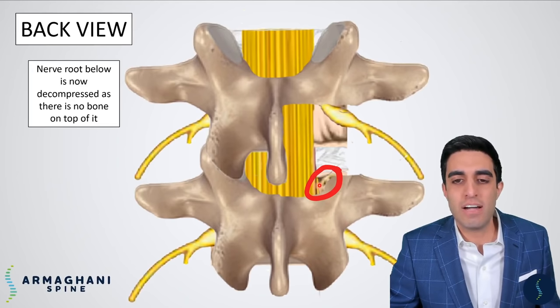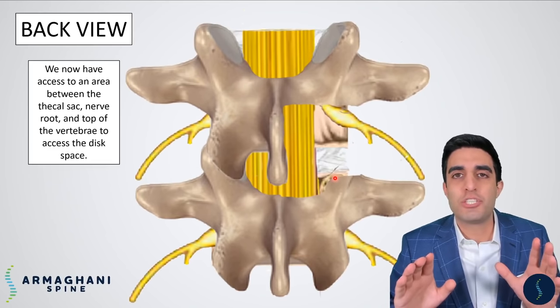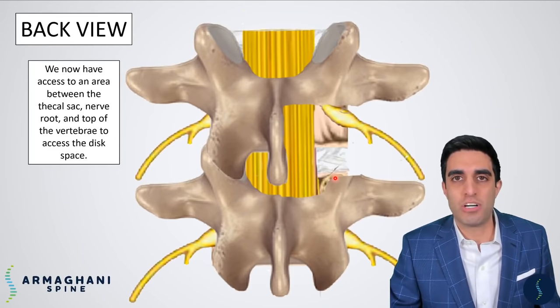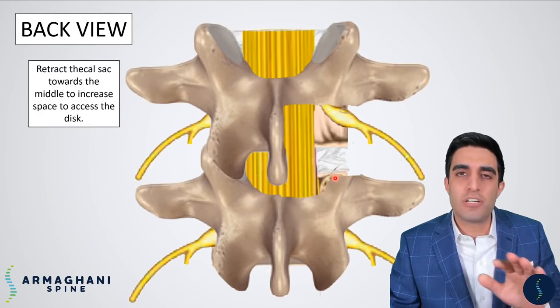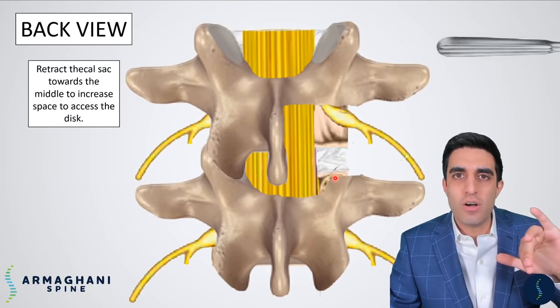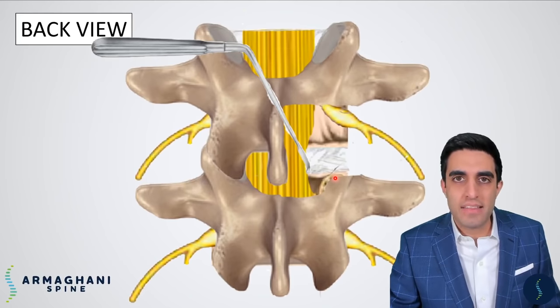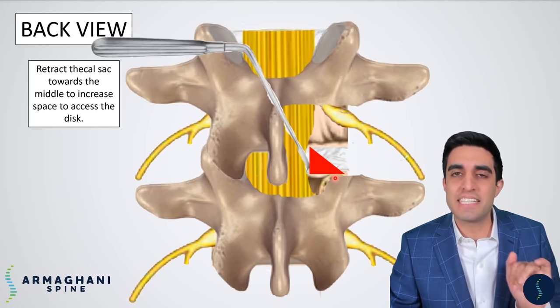The beginning of the nerve root is right here as it's going by the pedicle. Remember the location of the pedicle when we have to put in our screws later. We now have a situation where both nerve roots above and below are completely decompressed, and we have excellent access to our disc space, highlighted here in red. We still just need a little bit more space, which we get by inserting a small retractor to move the thecal sac over to the side so that we can see more of that disc.